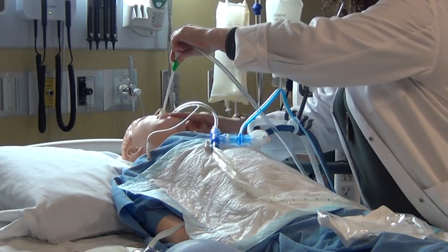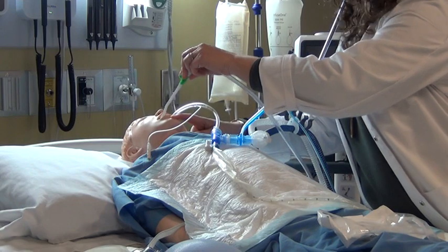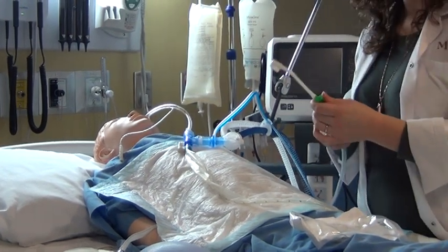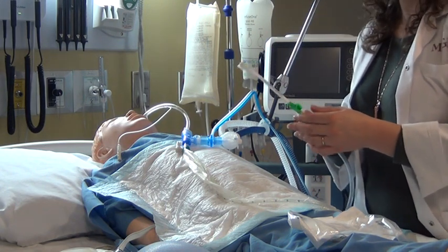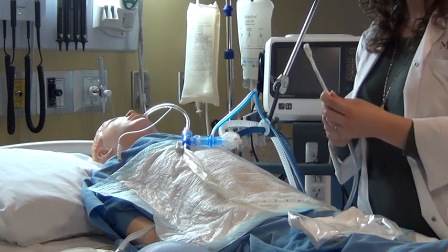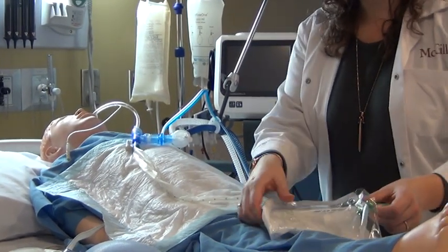As we go and brush their teeth, we are pressing on the suction to ensure that we don't drop any of that chlorhexidine or whatever mouthwash that we're putting. We ensure that it does not drop into their lungs and cause ventilator-associated pneumonia. So this is an important role for the nurse, the mouth care, done every 4 hours in a ventilated patient.